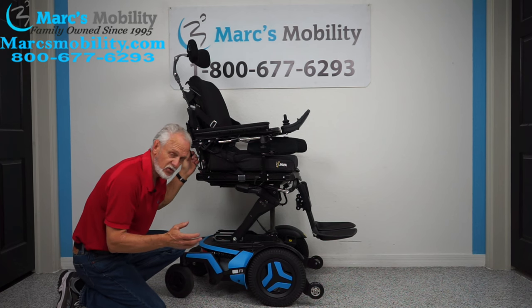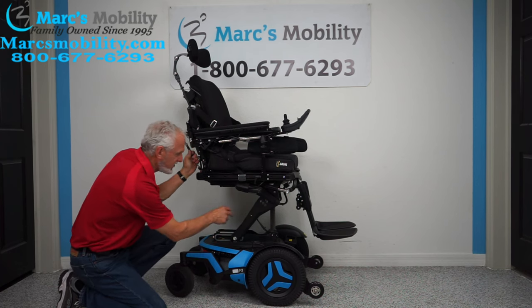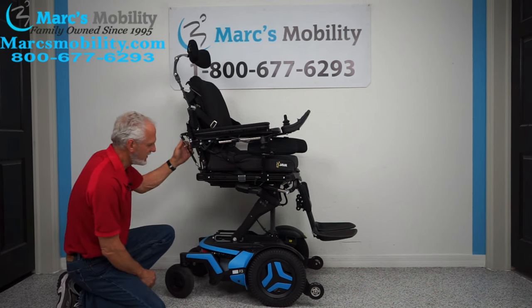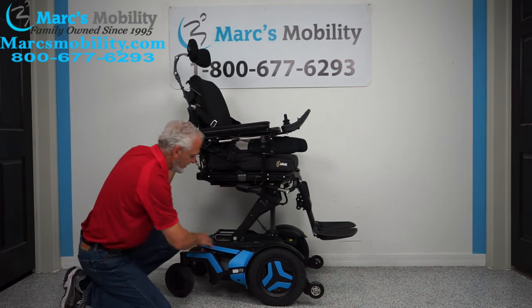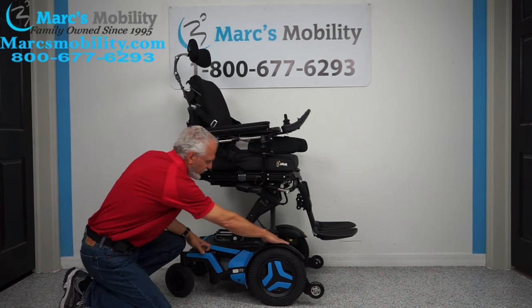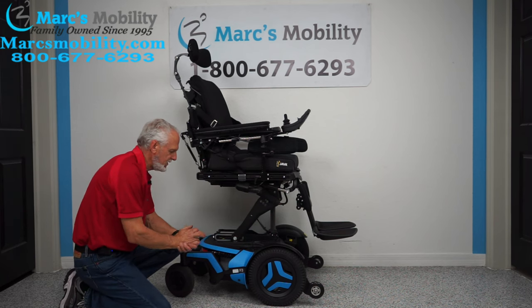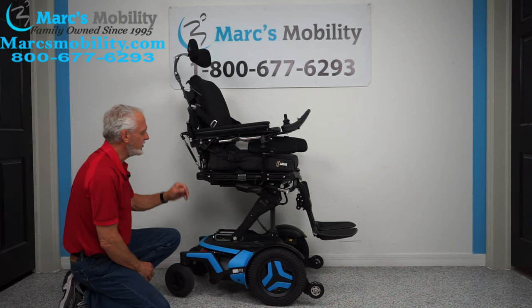This chair weighs about 425 pounds. With these four shocks and the weight of the user, you're going to have a really nice ride. There are anchor points here for tying your chair down — two on each side, so you have four anchor points total. This is where you secure your chair if you're going to hold it down on your lift when transporting it in your van.